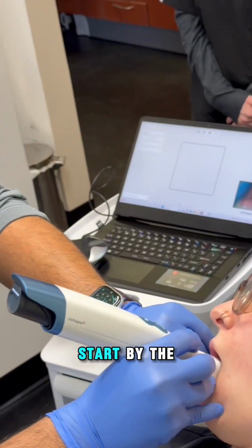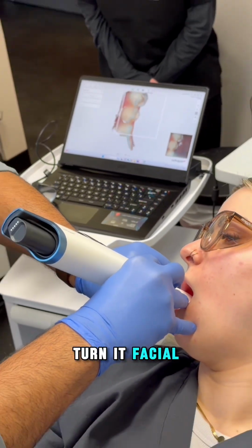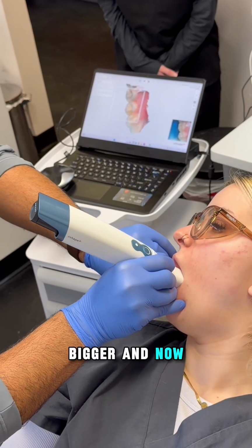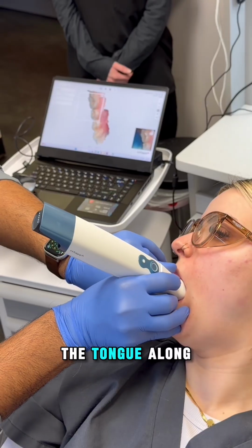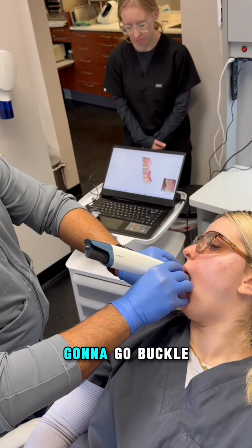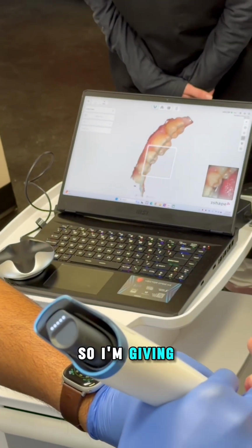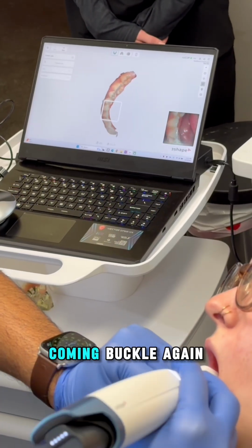I will always start by the premolar area, turn it facial, turn it lingual. Open a little bigger and now go back. So allow your scanner to push the tongue along so that the scanner is technically retracting the tongue along. And then I'm gonna go buccal like this. So I'm giving enough time for the software to recognize each previous frame. So now I'm coming buccal.